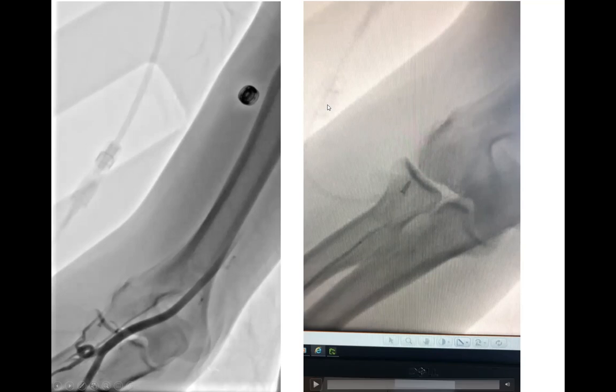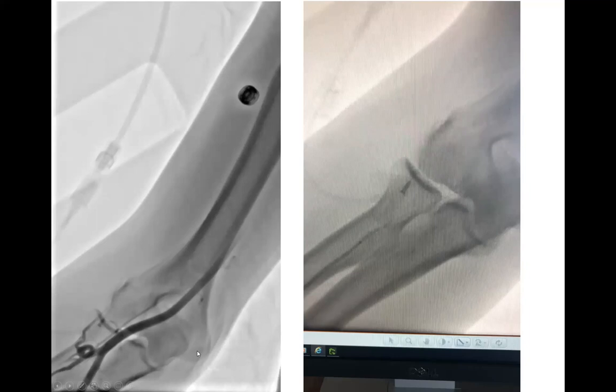This technique is called balloon-assisted tracking, or BAT — using a 0.014-inch guide wire and a 0.014-inch coronary balloon. Now looking at this still image: this is a right radial case with a 49-year-old patient trying to advance into the ascending aorta. What does this extreme angulation suggest?